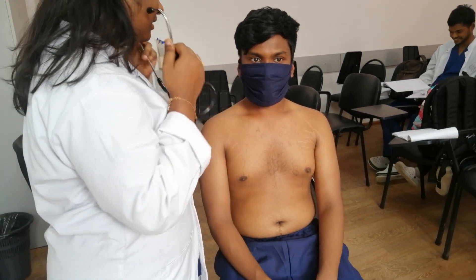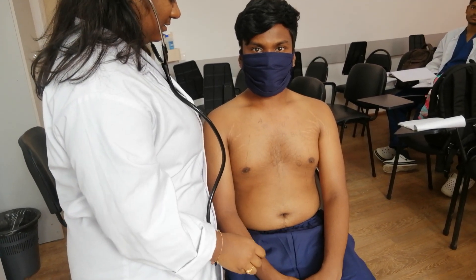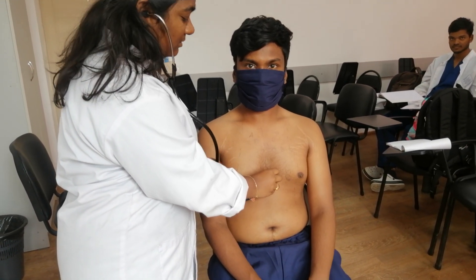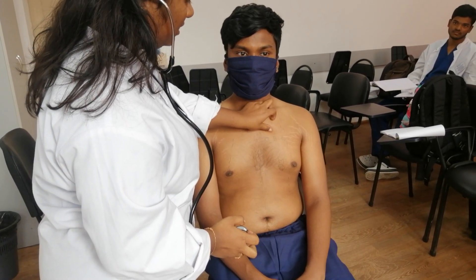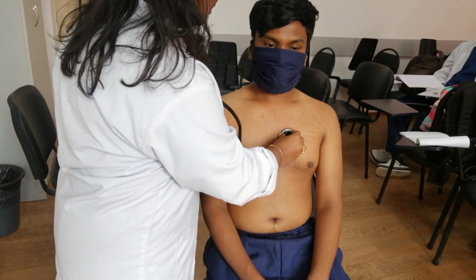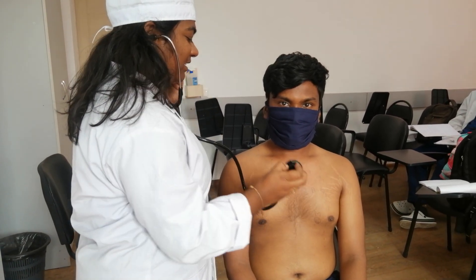Listen now. No — you need to listen at the left sternal border, third intercostal space. Find the first, second, and third rib, then go to the left sternal border. Now you are listening to the sound — very good.